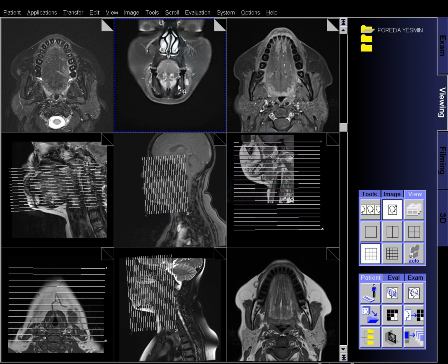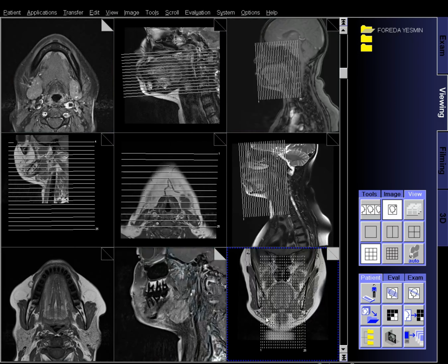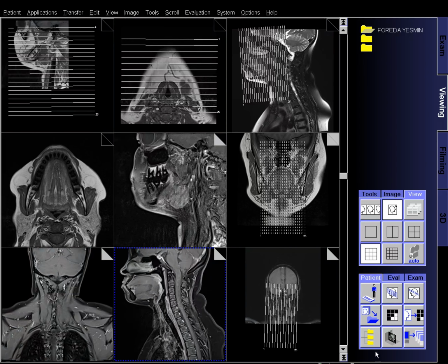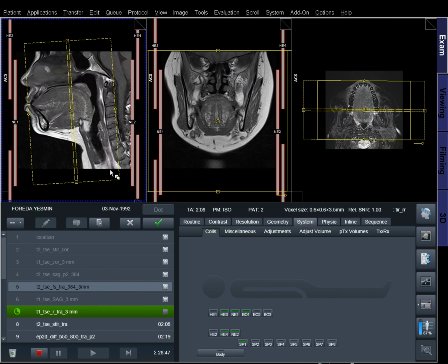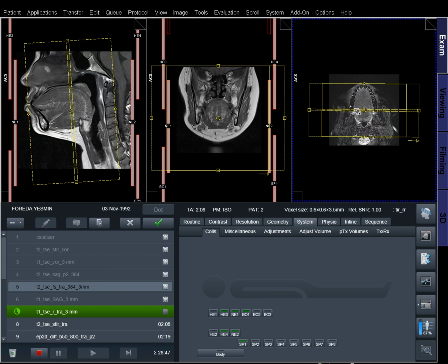By analyzing these three planes together, doctors can identify the exact location and nature of any facial abnormality. Additionally, using contrast helps to make inflammations or tumors more clearly visible. Proper face MRI planning ensures the scan is accurate, detailed, and clinically valuable, helping in faster and more precise diagnosis.